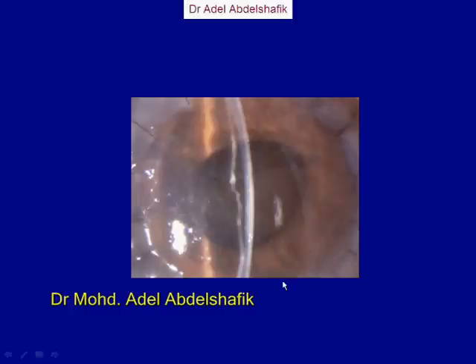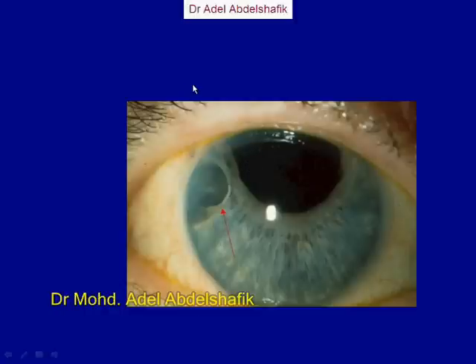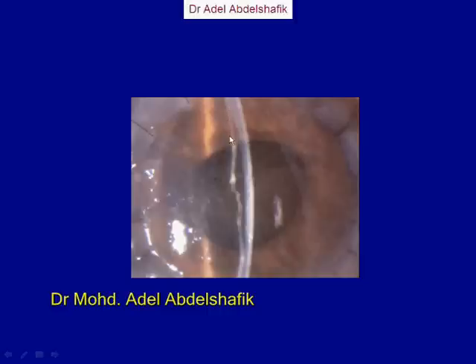I see some sutures here, so it looks like it's rounded all over, it's keratoplasty. Then we get this section in the cornea, and we have this membrane behind. So we get a homogeneous surface folding in the AC. Most probably this is detachment of the Descemet's membrane of this cornea.